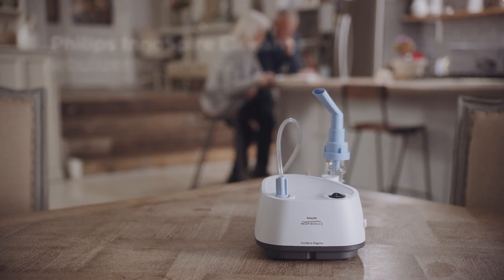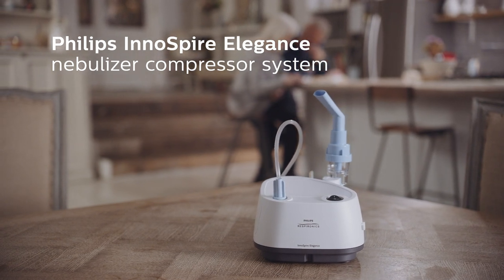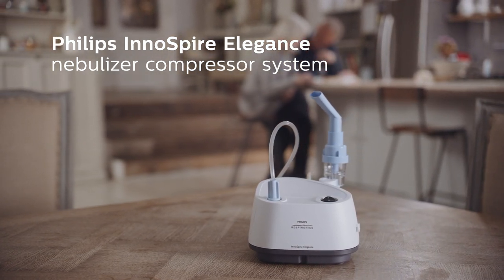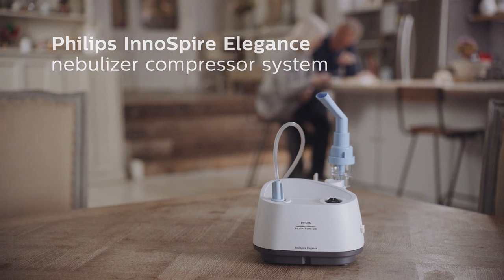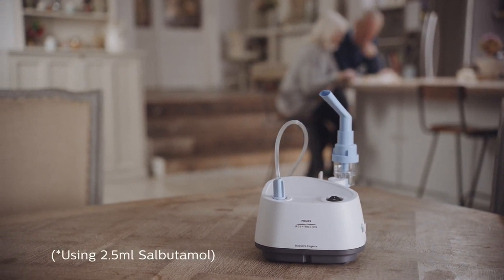The Philips Inaspire Elegance Nebuliser Compressor System offers reliable aerosol therapy designed for continuous use at home, with the highly efficient Sidestream Nebuliser providing fast treatment in as little as 6 minutes.